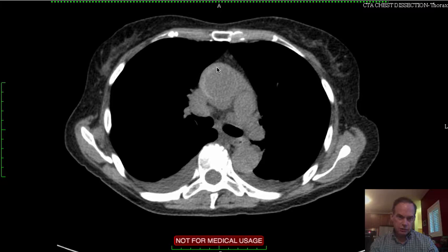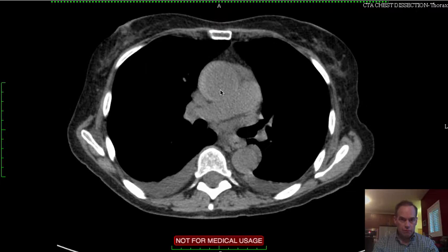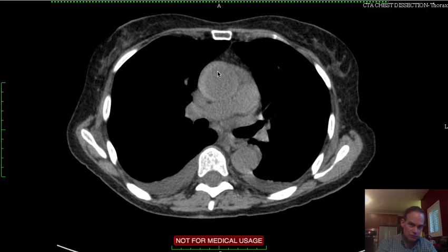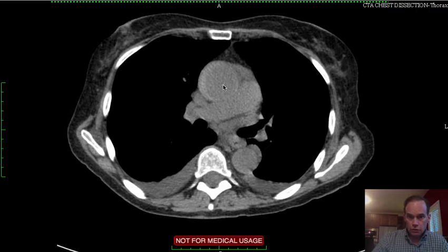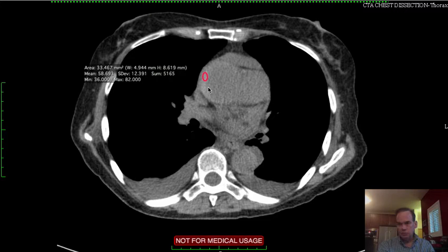And it's a little more conspicuous now. Going down still slowly, you can really see on some of these images very clearly — for example right here — just how high attenuation this area is compared with the lumen of the aorta. So how high attenuation is it? We will see that it is 59 Hounsfield units, just about 60 Hounsfield units, which is very typical of hemorrhage.